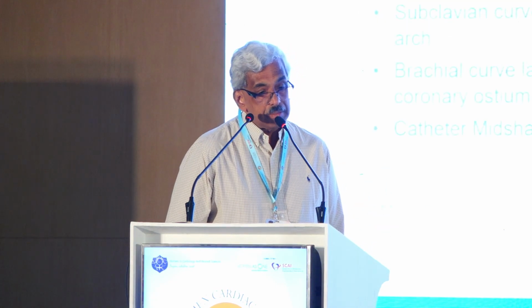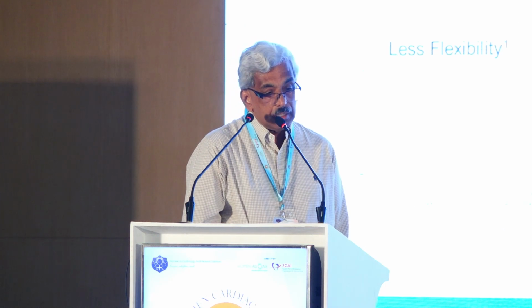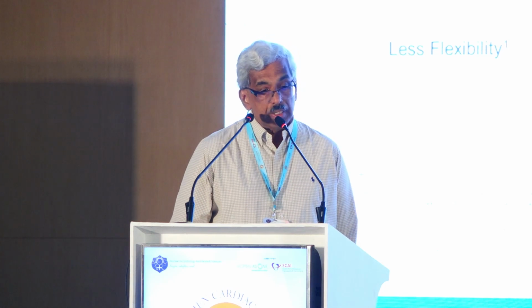I think that this is a good delivery system. I've used it in very tortuous radial arteries with no backup, and these stents go very, very nicely around these bends. So I think this is another interesting innovation of laser cut hypotubes, which makes the stent very, very conformable and flexible with pushability. So I'd like to conclude this slide by saying that we are getting these stents which are trackable, which are optimal, which are strong, both radially and axially.